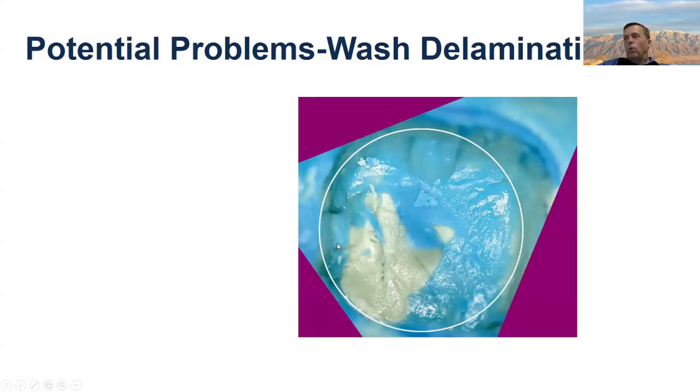It makes everything so unpredictable, and that's not what we want. We all want to take an impression, send it to the lab, make the stuff, deliver it. That's what we want. So if you avoid doing this, it'll help. I wouldn't, and just as an aside, if you get this, always take a new impression, even if it looks pretty good, because you can assume that this problem is happening everywhere, even in the areas you can't see.